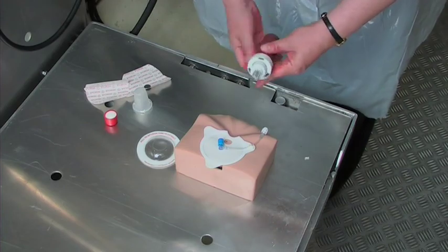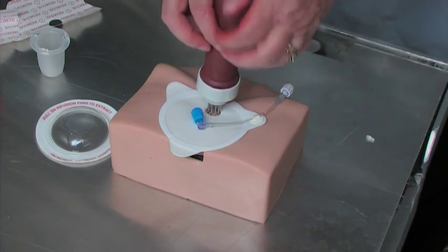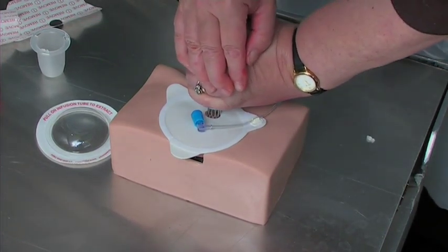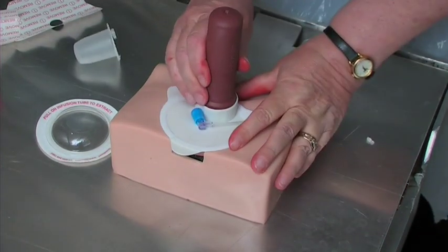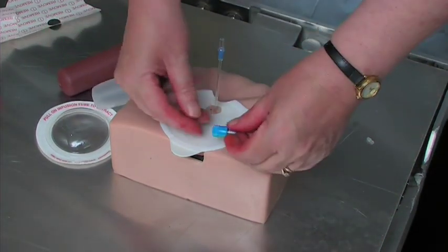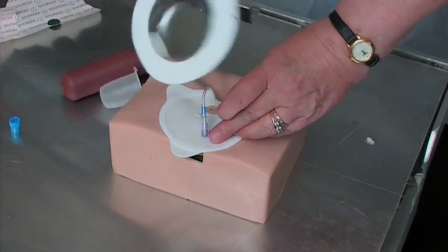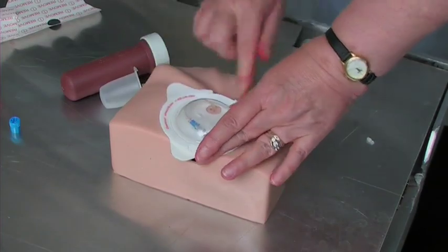So you place this in the centre of the target patch, and then it's just a case of firm and steady pressure. And then carefully remove. We have the needle. Take the blue cap off, attach it, and this is just a safety device to prevent it being pulled out.